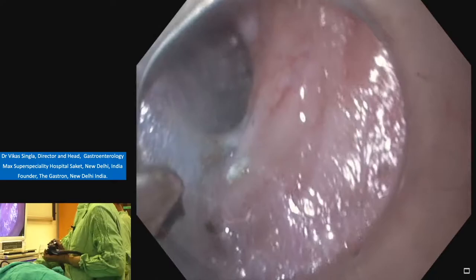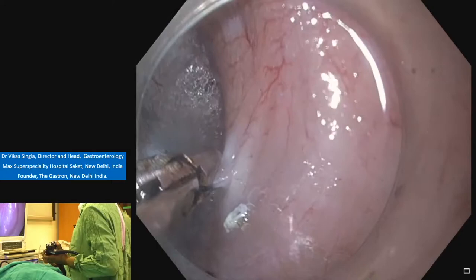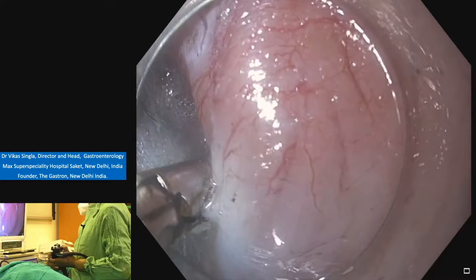Open. We cut with the cutting current, Endocut Q. Effect 2, duration 3, interval 3. Last is the cut.